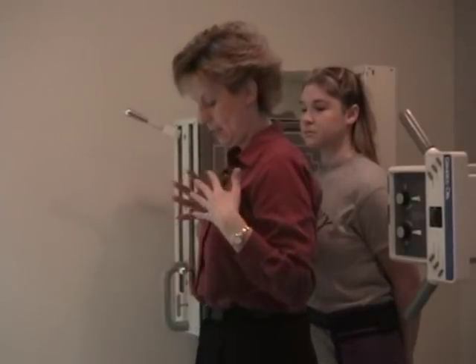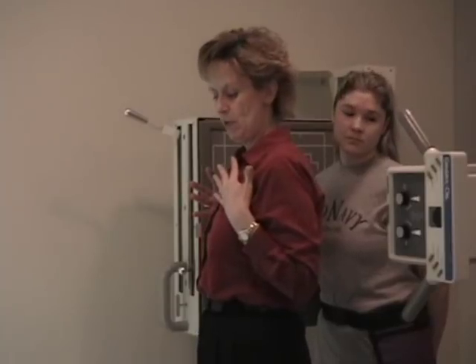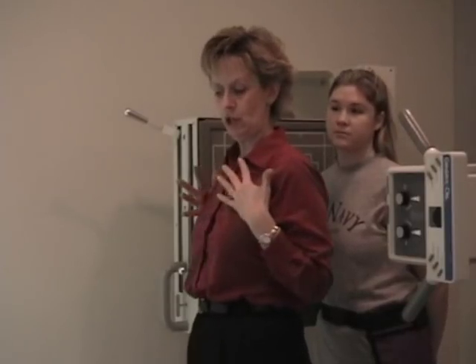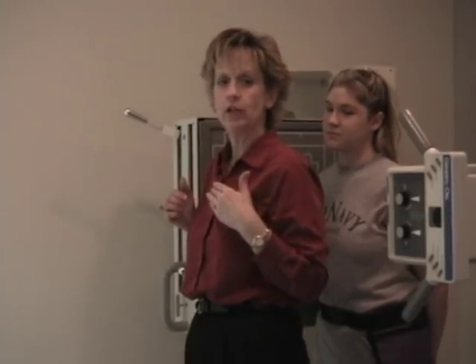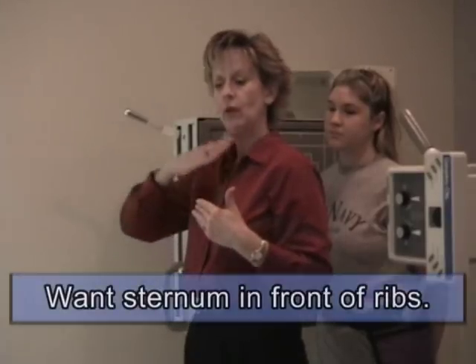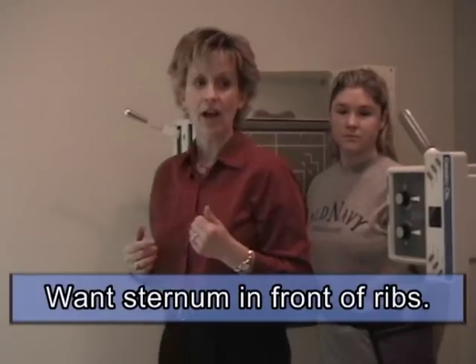And if you're not in a lateral position, let me kind of mock here what will happen. The ribs come into the sternum here. And if you don't have them in a true lateral position, the body shifts, and the ribs will actually tend to come and cover up the sternum. And in layman's language, I call these nubbins. If you see nubbins or bumps on that sternum, the patient was not in a true lateral position. You want the sternum in front of the ribs. Okay? And that completes a sternum exam.